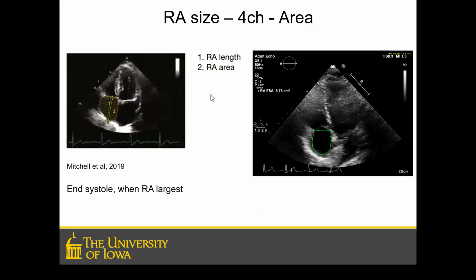And then we have the RA measurements. These are done in end systole, just like the LA ones. As I mentioned, not necessarily in the same image, because you want to optimize the image to the true size of the RA, usually not in the same plane as the LA. You're going to do the same type of trace, the same things apply. You don't want any dead space with that method of disc analysis, and it's just the chamber. Don't go out into the SVC or anything.